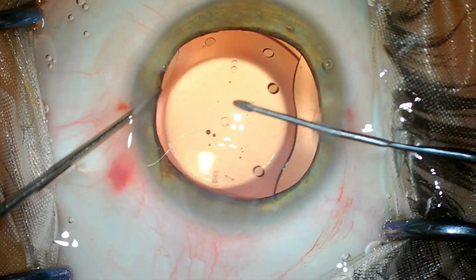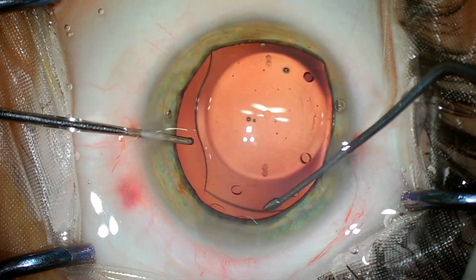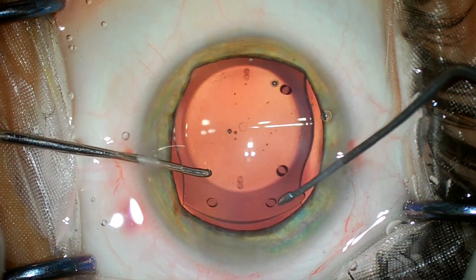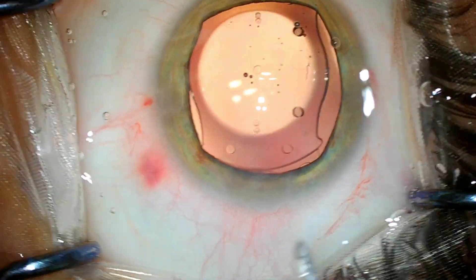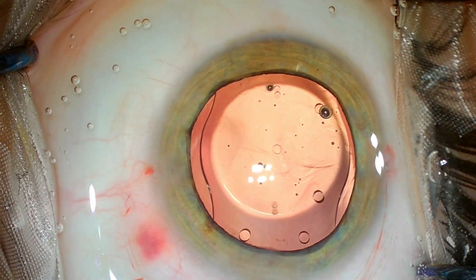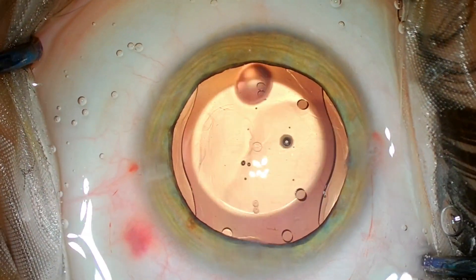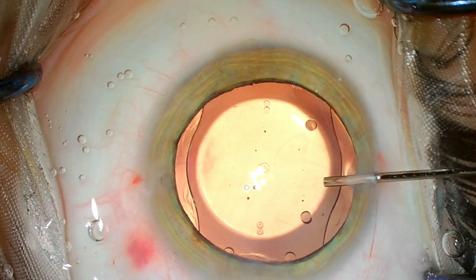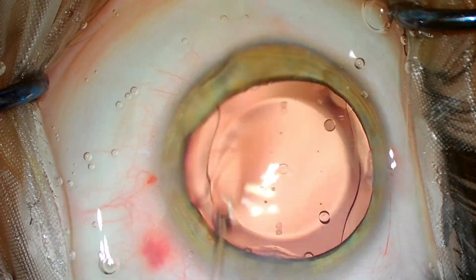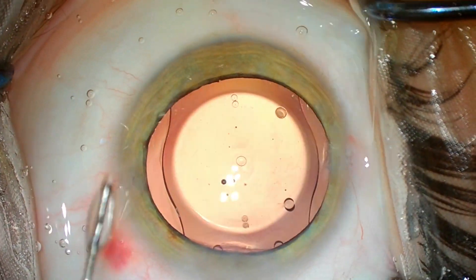As I showed in the previous case, if the IOL opens reversed — which happens very occasionally, maybe once in 100 cases — it's better to take it out and re-inject. Don't try to rotate it inside the anterior chamber, which doesn't have enough space, as you may end up with endothelial problems. It's a very safe phakic IOL to use. Over nine years I have seen no loss of specular count — the endothelium is safe. Cataract formation is very, very rare; I have seen only two patients out of 800 over the last nine years who required cataract surgery after this IOL.